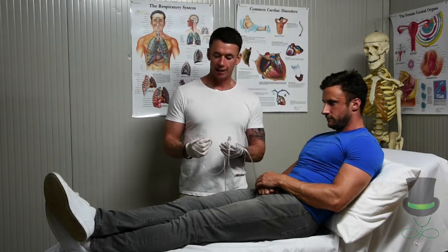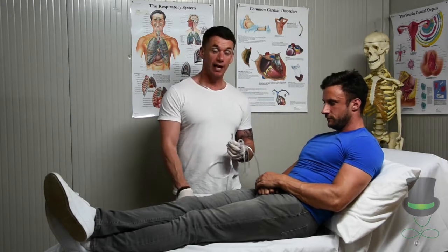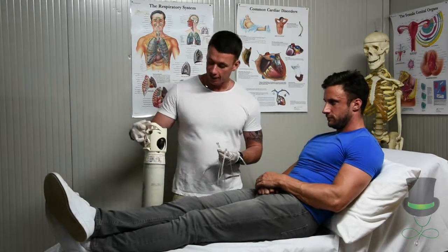After removing the nasal cannula from its protective packaging, we need to attach it to the oxygen bottle.